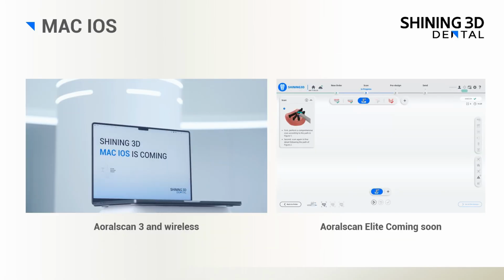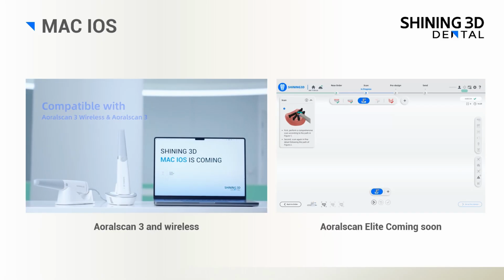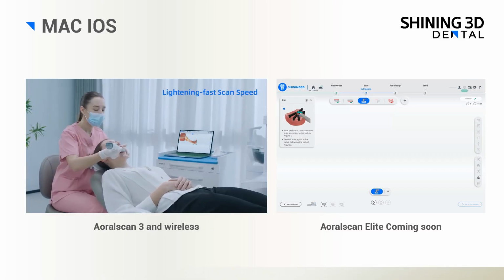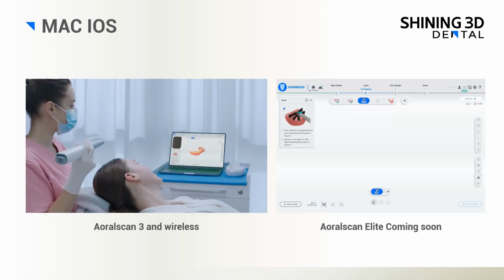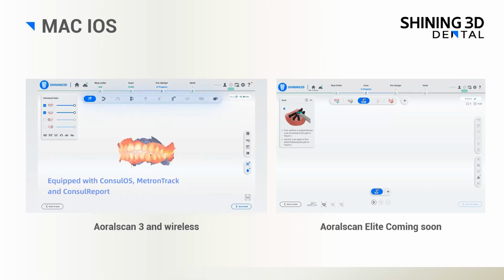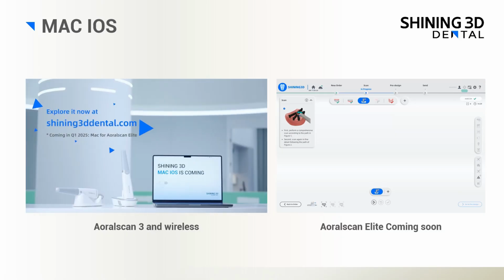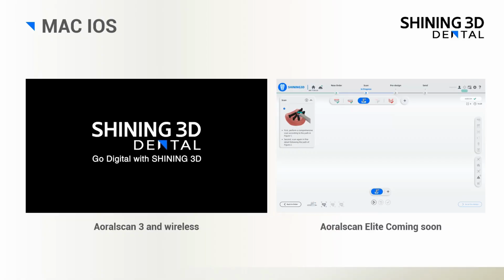Last but not least, the final update for the Aoralscan software is the Aoralscan software on macOS. Currently, the Aoralscan 3 and 3 Wireless have Aoralscan software on macOS, and you can find the exact version on our download page of the Dental Support Center. The Aoralscan Elite version of the macOS software is coming soon, and it will be released in the first quarter of 2025.